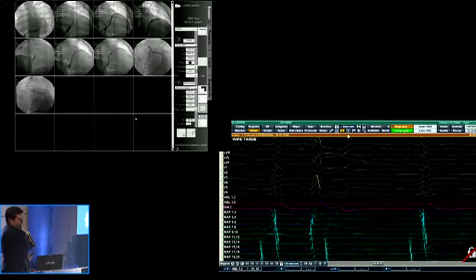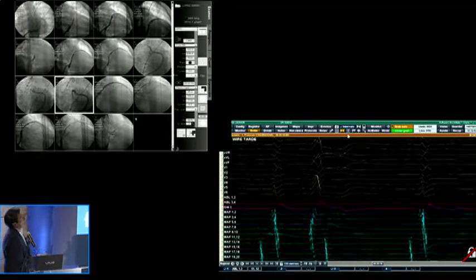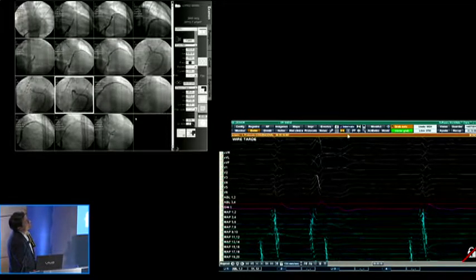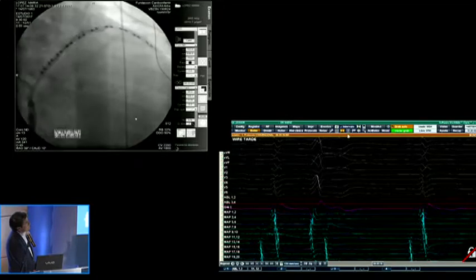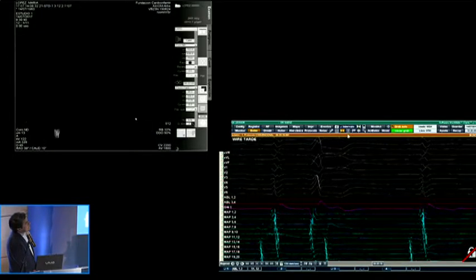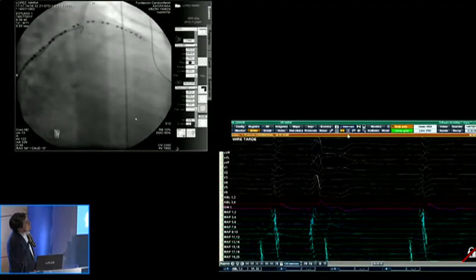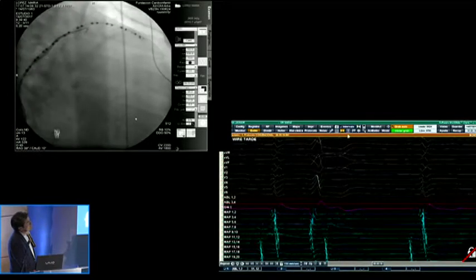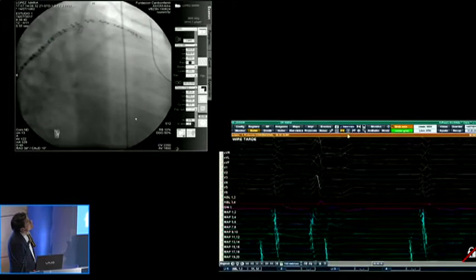to see whether we could get a better signal than the 13-14 signal. We didn't find a septal perforating vein at 13-14. They are more distal. So in this perforating vein where we are injecting, we were able to advance the Biotronik Vision wire to get unipolar signals of the perforating vein. You can see it on the image, and it's late. We would have liked to find a vein at 13-14, but there are no veins at this point.